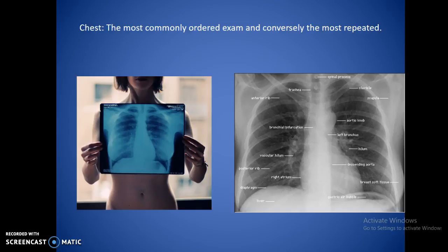It's the most commonly ordered exam and the most repeated simply because of the volume that you do. You're going to start with learning the chest x-rays in your clinic, and you'll have plenty of practice as you try to get better and better with your collimation, but also the proper field size, the markers in the right spot, all the different chest views that we do as well.